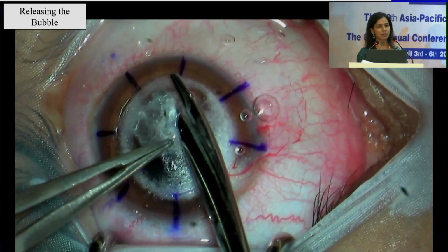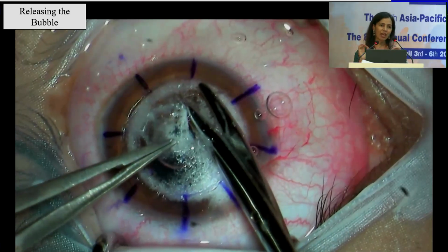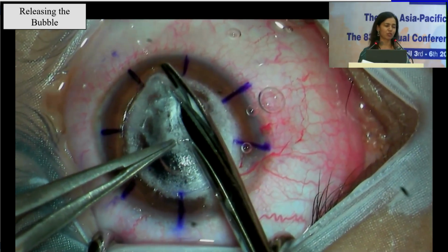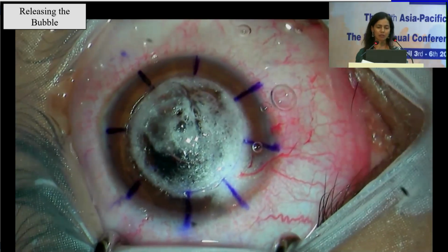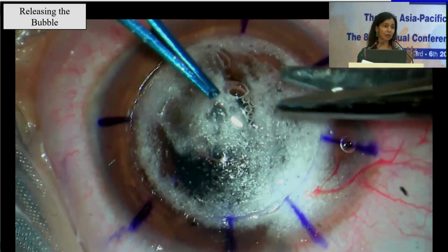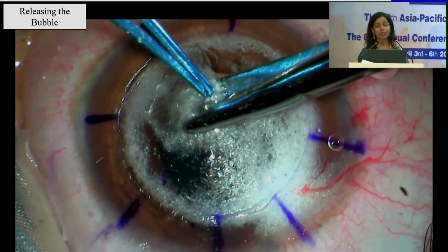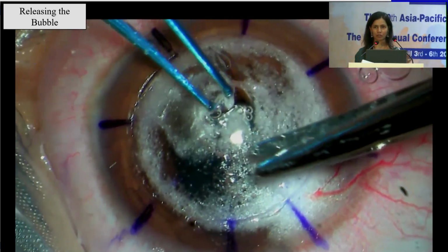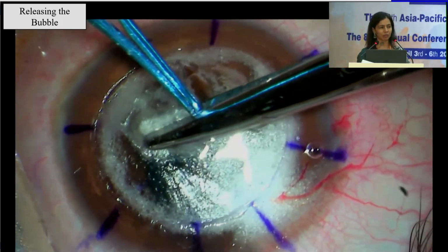These are blunt tip scissors, and it doesn't matter which ones you have. Have micro scissors with a blunt tip, invaluable in your dissection of the posterior stroma. Go in bravely, nothing is going to happen. The tip is blunt, the edges are blunt. And the DM endothelium, because this is the pre-Descemetic layer, because this is a type 1 bubble, and the pre-Descemetic layer is incredibly strong. It really takes a lot to perforate it once you've got the type 1 big bubble.